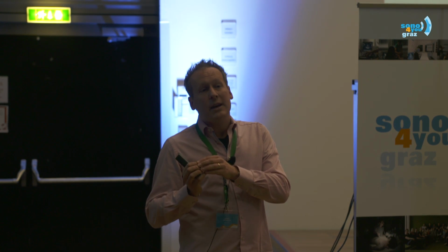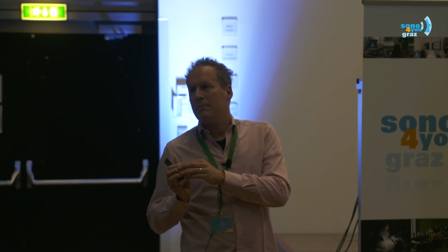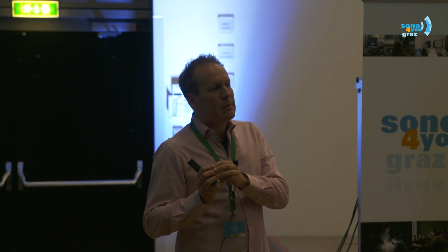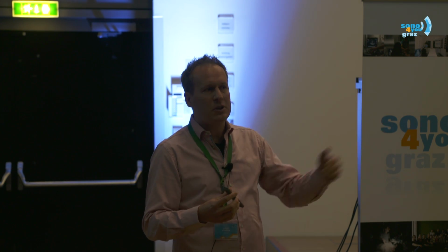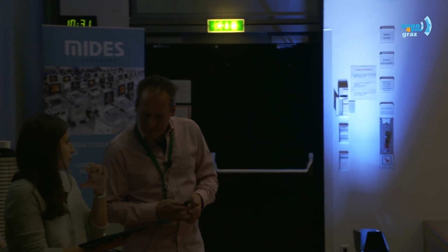Most of the studies have been conducted with the echo probe. So you should rather use the echo probe if you start scanning for interstitial syndrome. But if you compare, you can just use the other probe again. There won't be much variation. And for ruling in the syndrome, it's okay. And also for the follow-up, if you continue and look if it's getting better or worse, you can use any probe.